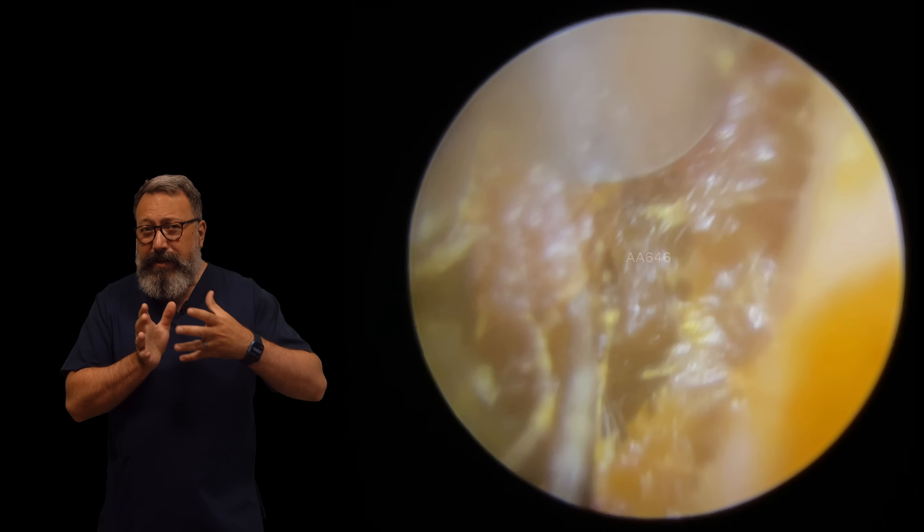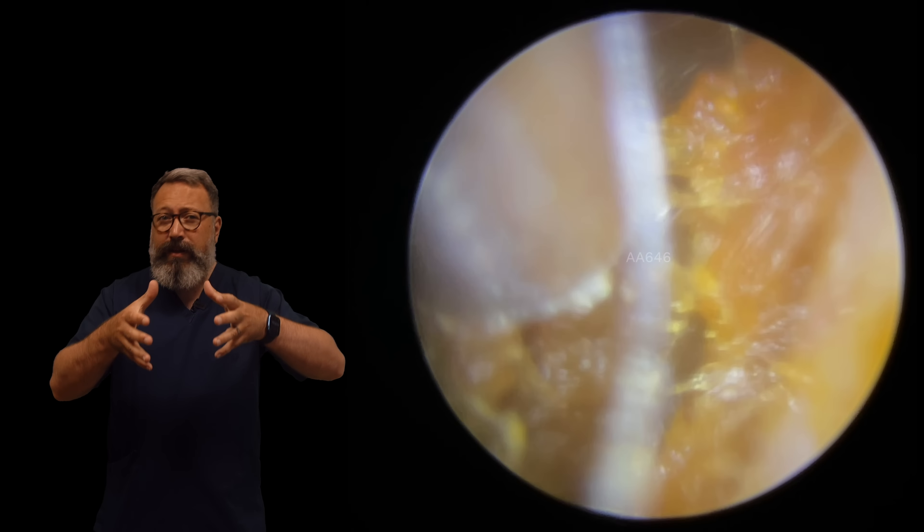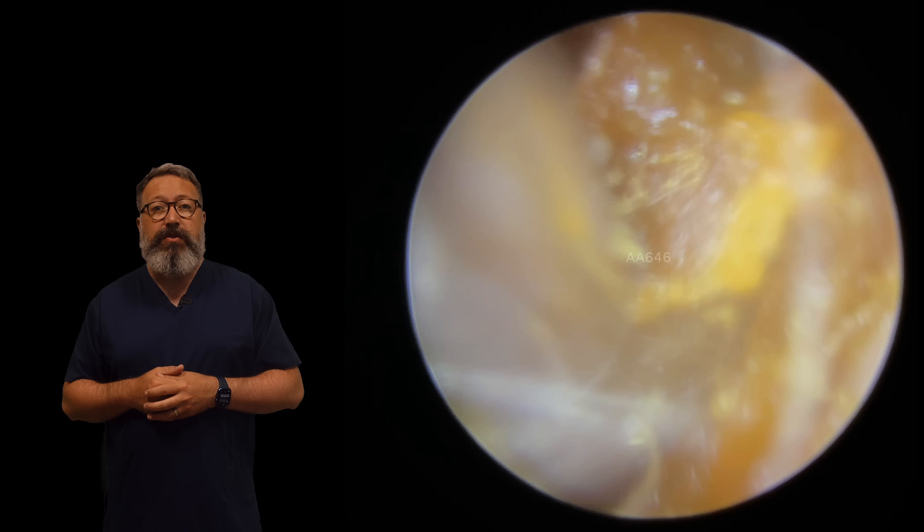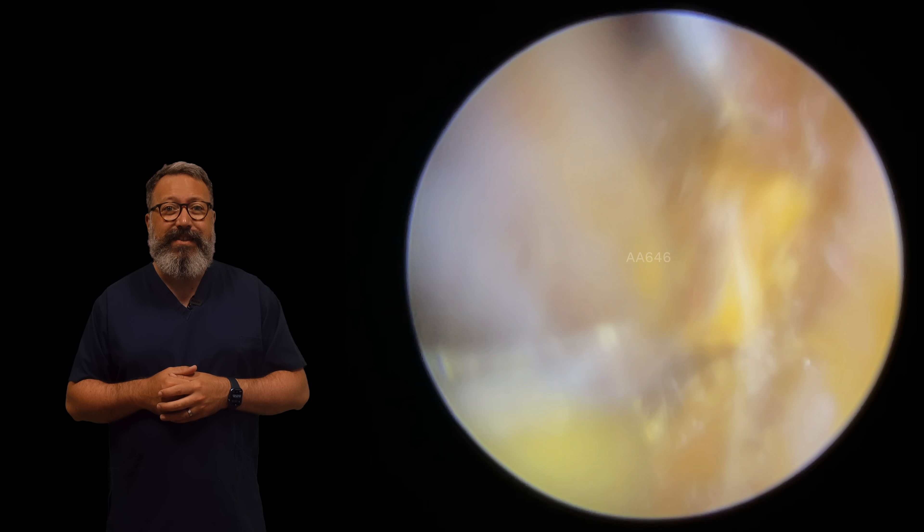As you're trying to negotiate the two bends in the ear canal, you're kind of bending it and wiggling it back and forth, but it doesn't always wiggle around the corners very well. So I'm just using the suction tube here just to tease this down the canal.